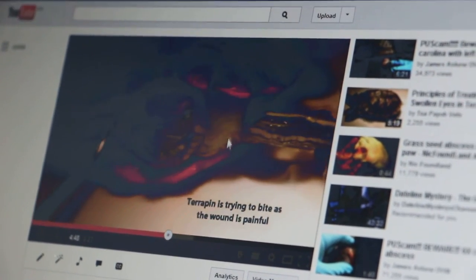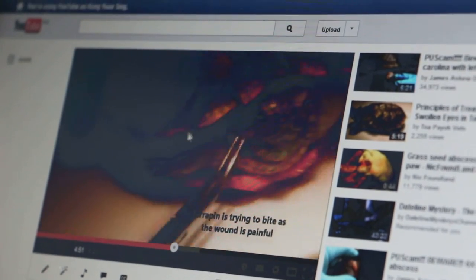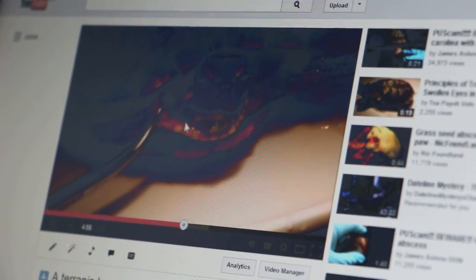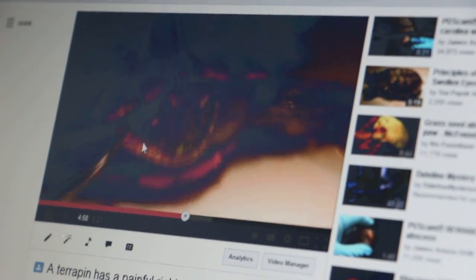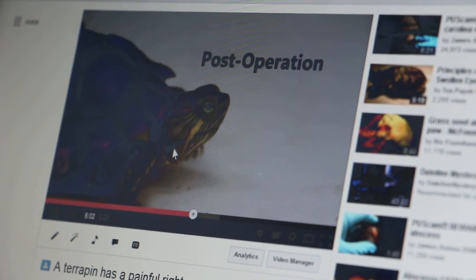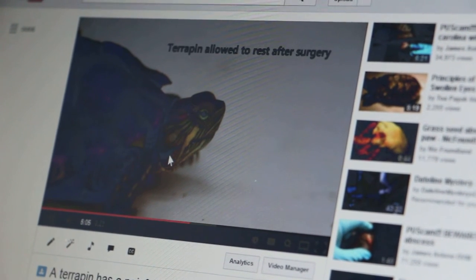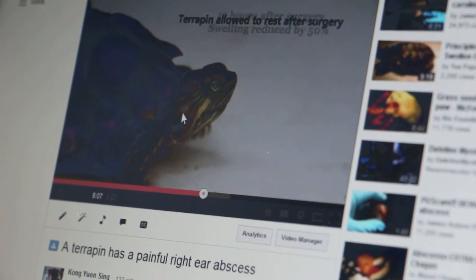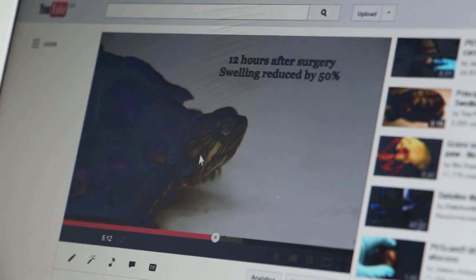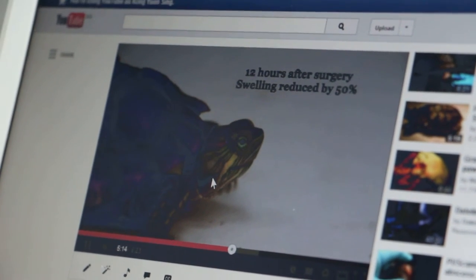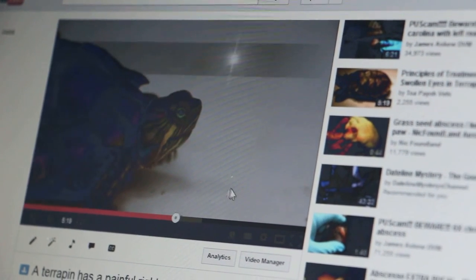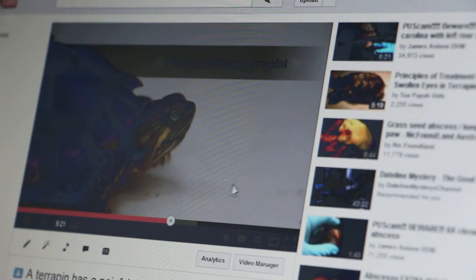The anesthesia must not be too long, otherwise the terrapin will die. Of course, the terrapin is not too happy with the procedure. This shows all the swelling. After the surgery, the terrapin was allowed to rest. 12 hours after surgery, the swelling had been reduced by 50% and the terrapin was stable. As a follow-up, the owner reported that 7 days after surgery the terrapin had started to eat — a very good sign — and was in fine shape.